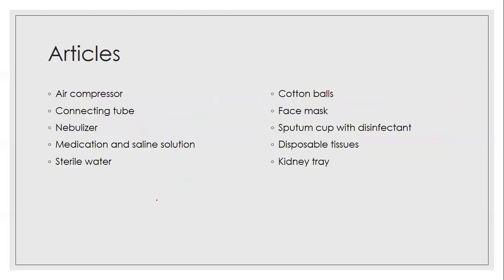Next, these are the articles needed for delivering the nebulization. An air compressor should be connected to the nebulizer — this is the most important instrument needed to deliver the nebulization. Then, medication and saline solution: according to the patient's problem, the doctor will prescribe the medications, and we can add them into this nebulizer and provide nebulization. Saline water can also be used. Cotton balls, face mask are also needed.